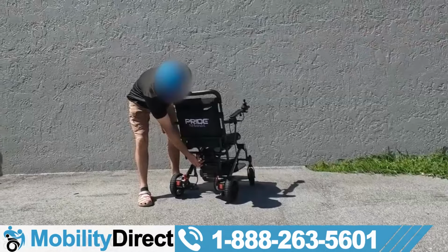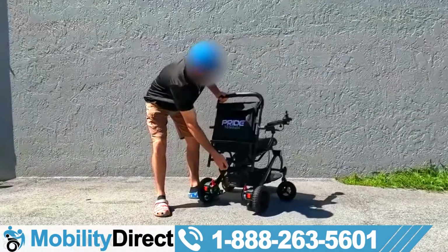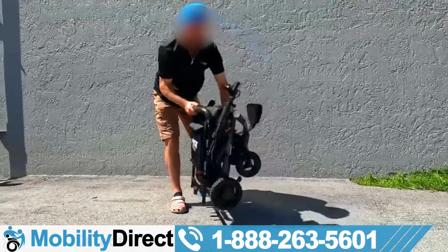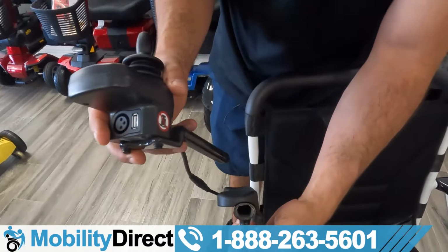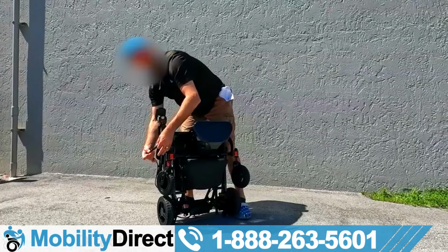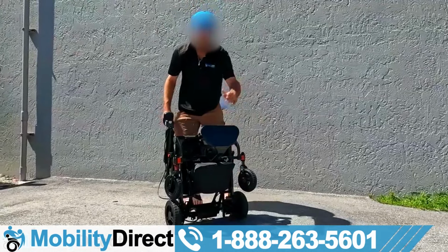So to fold this thing here in the back, you got this little lever here. Just pull it up. Folds down very easily. If you're planning on traveling, I would recommend removing your joystick. You can loosen this twist knob here. Pulls right out, and then you just unplug it here. You got the little storage bag down there to keep it closed. There's a little strap right here.